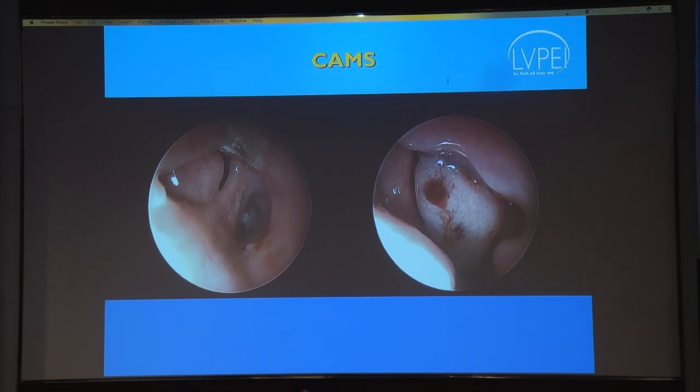Then the image on the right hand shows the endoscopy of the right side, which shows a very large middle turbinate. This is a hypertrophied middle turbinate. So now in this particular patient, the nose has not developed properly, but the lacrimal system has been developed. So how do we deal with this case now? So a possibility for management remains that we make lacrimal sac flaps on the affected side and somehow we join it to the septum so that it opens into the opposite side.